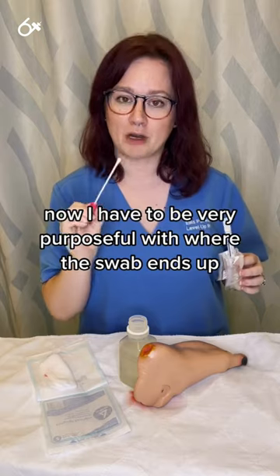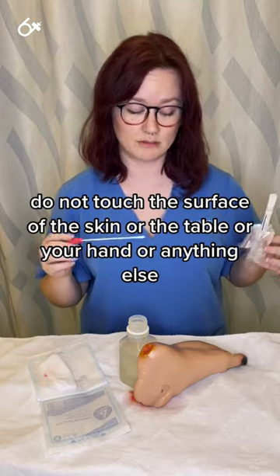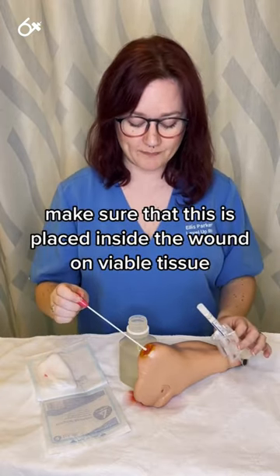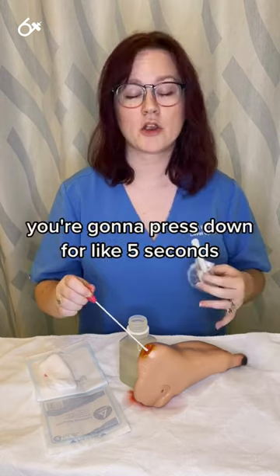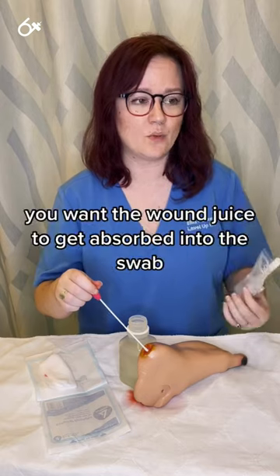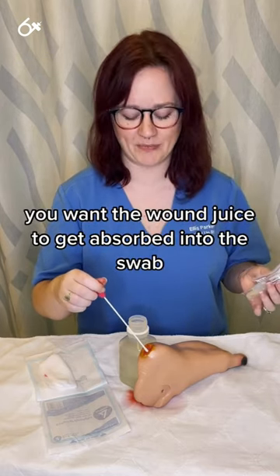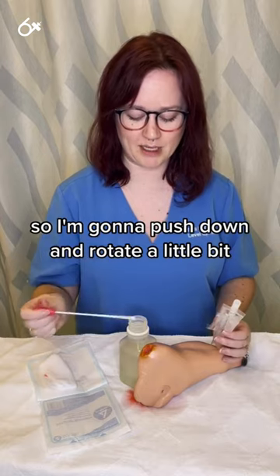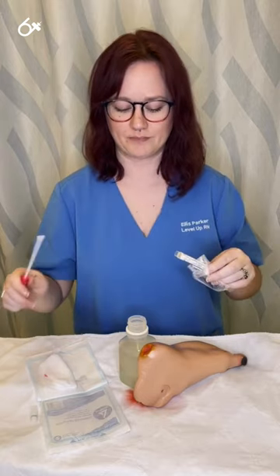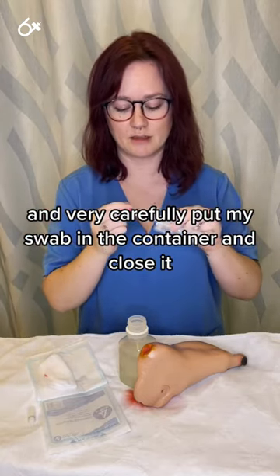I have to be very purposeful with where the swab ends up. Do not touch the surface of the skin, the table, your hand, or anything else. Make sure the swab is placed inside the wound on viable tissue. Press down for about five seconds to push out some of that exudate — you want the wound fluid to get absorbed into the swab. So press down, rotate a little bit, collect that fluid, then carefully put the swab back in the container and close it.